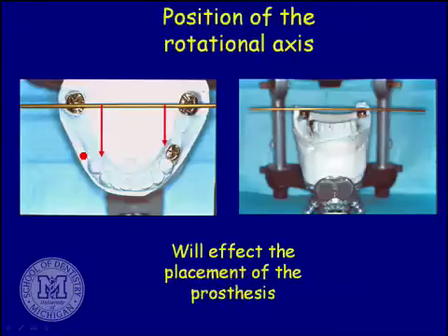If the rotational axis is fairly straight across the arch, side to side, and looked at from the front it's also fairly level, what happens when this partial denture is going to rock to place is it's going to rock pretty straight down in place. Could you see that if it was a situation in which the posterior plane of occlusion was uneven from side to side? Let's say, for whatever reason, this tooth sits taller in the air than this tooth, and so instead of going like this, the plane runs downhill like that. Can you see that if the plane is tilted like this, when the thing rotates, it's going to rotate diagonally coming down? People follow that?